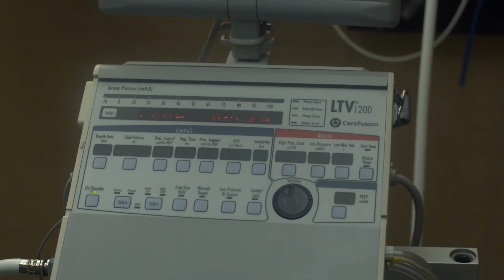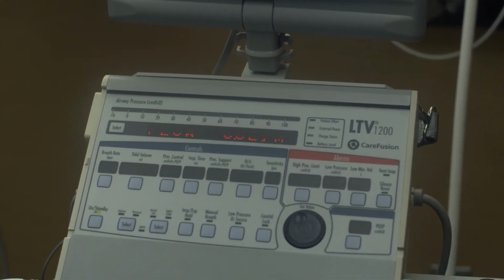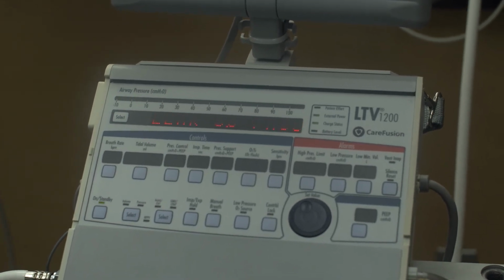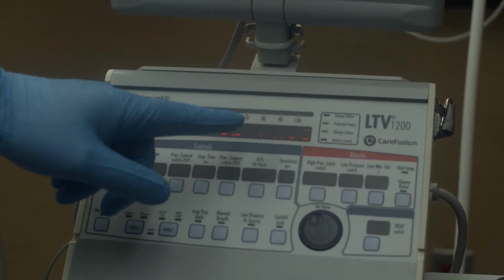If the system fails again, replace your circuit with a spare from our storage area and retest it. Any ventilator failing a leak test with a brand new circuit should not be used for patient care. You will need to call for help immediately and bag the patient. Now you can see the leak test has been passed.